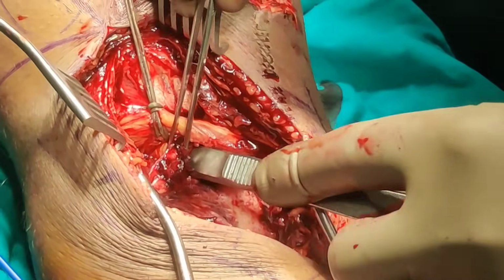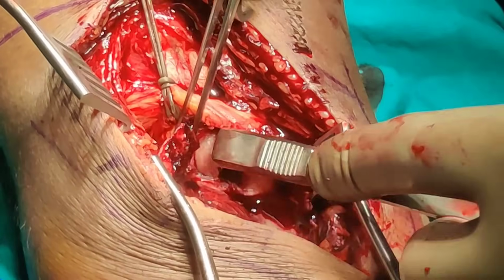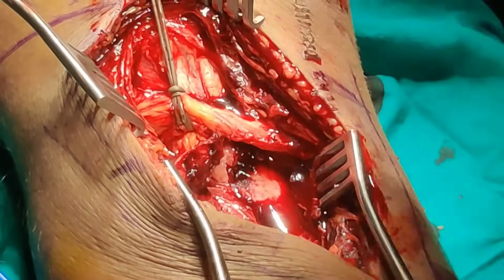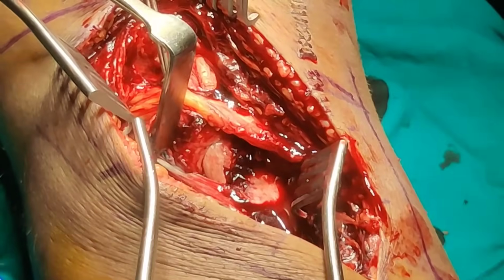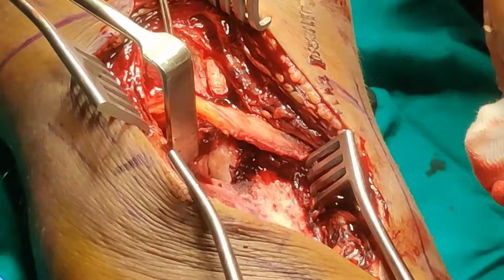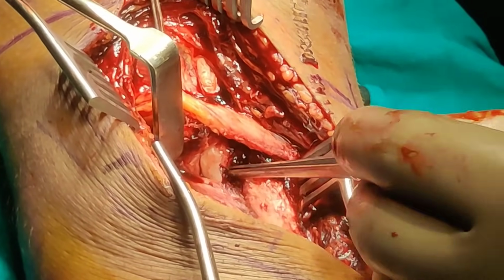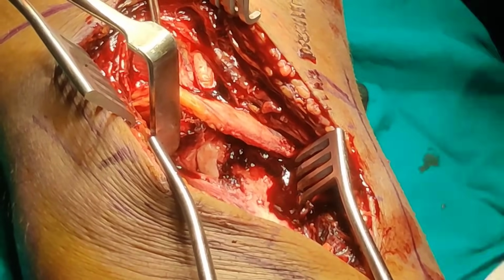So this is the apex. If you can see here, can you see here? This is the apex. If you can have a Langenbeck please. And Prashant is pretty good in doing camera work and otherwise as well. So if you see this, this is the apex. Now once you are on the apex, we are on home ground, isn't it?